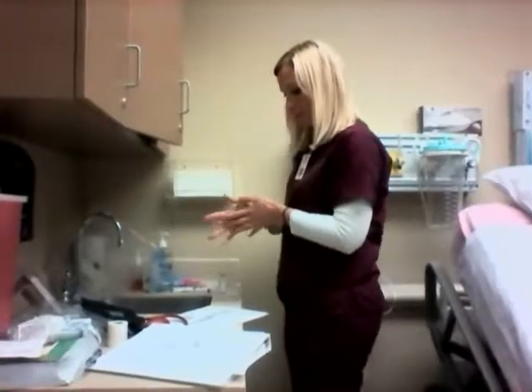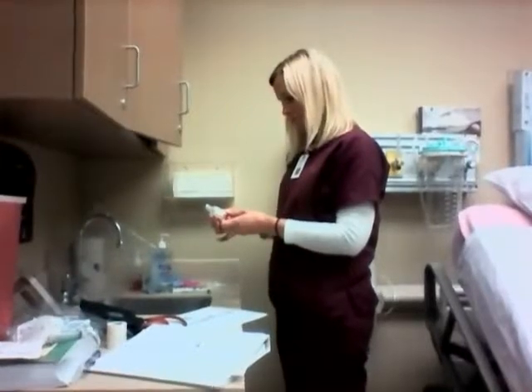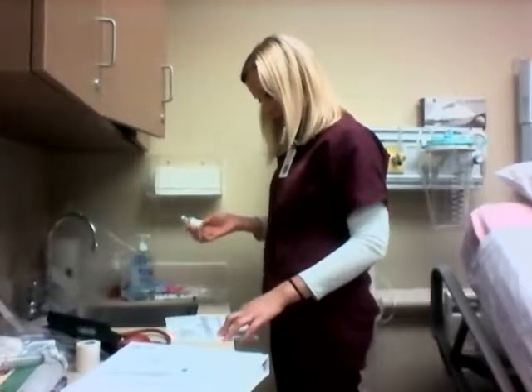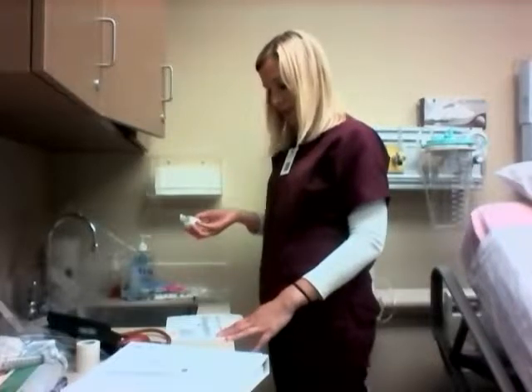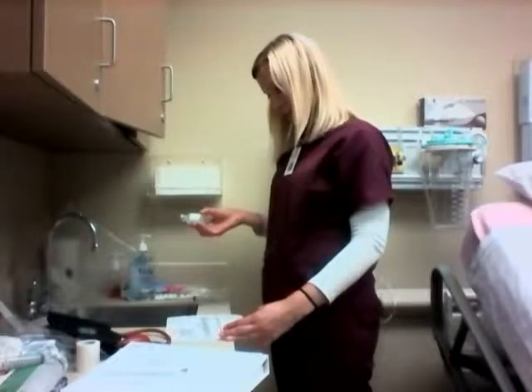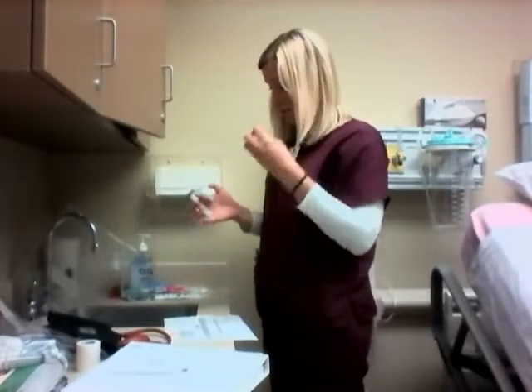And the first one I'm going to do is the IV stat dose. So I'm going to find my vial, and it is Cardizem 25 milligrams per 5 mils. And that is what I need. I'm going to be giving her 5 mils because our order calls for 0.25 milligrams per kilogram, and after doing the math, it looks like she needs 25 milligrams. So I'm going to take this along with my syringe, and I'm going to go back to my nurse's station.